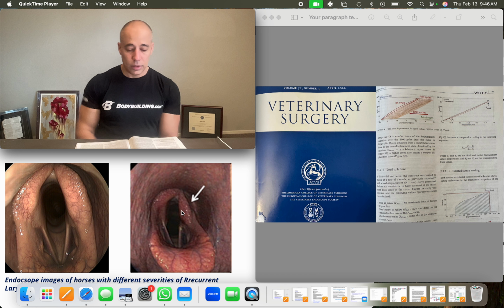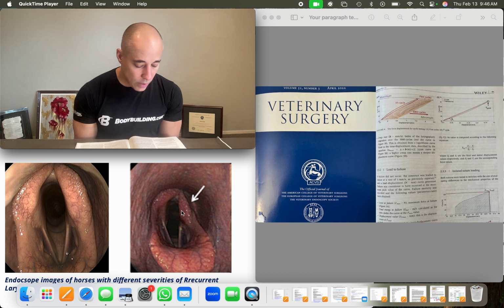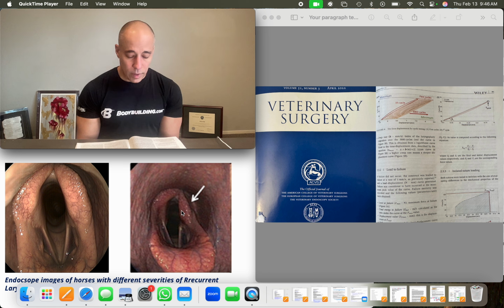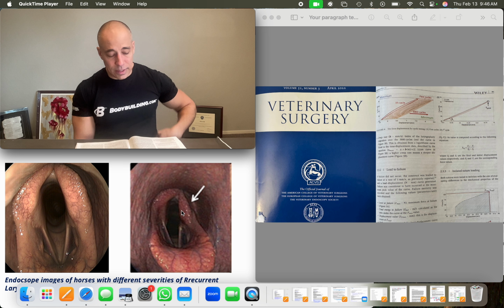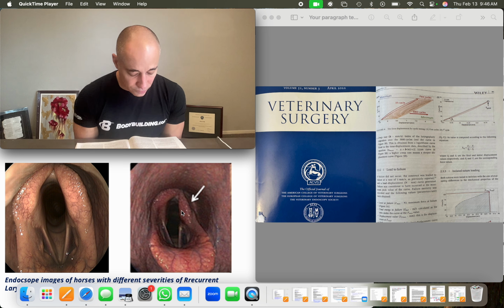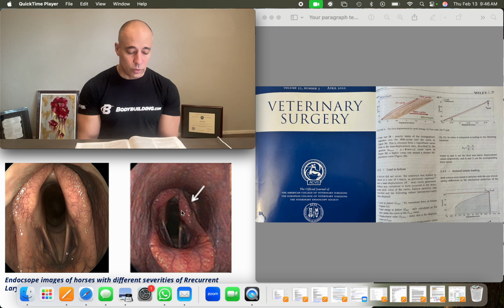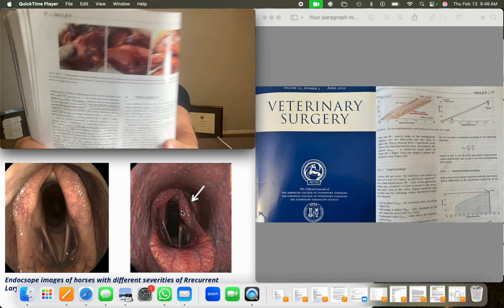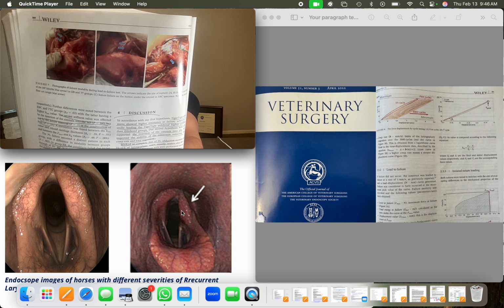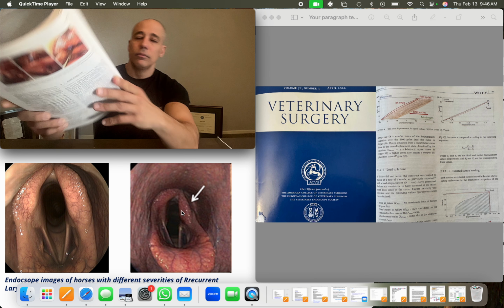Okay, discussion. Tiger tape specimens showed higher resistance to failure, whereas at cyclic loading, the Tiger tape exhibited higher stiffness than ethibond. The insertion of the cannula into the muscular process improves stability of the constructs, reducing creep rate and total migration. These are pictures showing the failures. Those blue arrows show where the constructs failed.